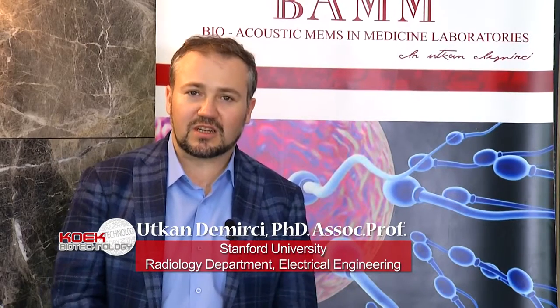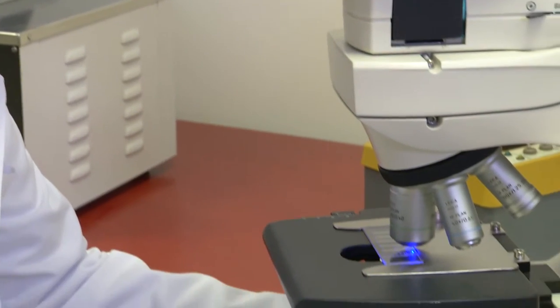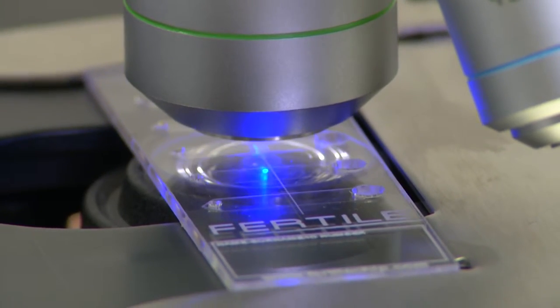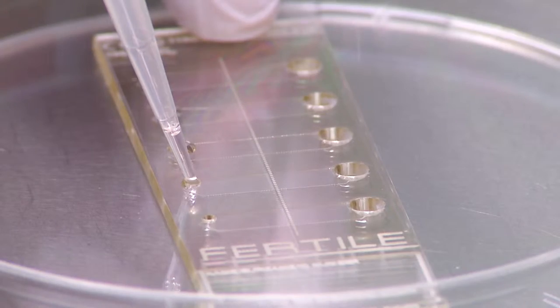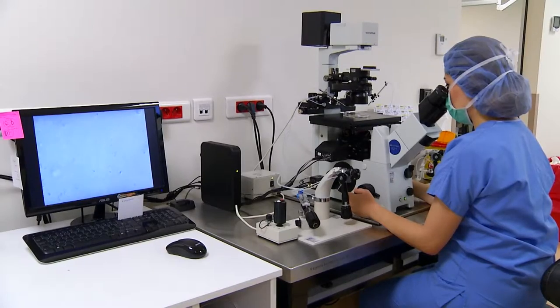This technology is inspired by nature in the sense that sperm moves in the vaginal walls through microfluidic channels to get to the egg, and it's pretty much programmed and designed to swim up towards the egg. Here we are creating that same type of path using microfluidic channels and microfluidic technologies to have the sperm race against each other, and at the end we end up picking the best sperm that can be used for ICSI or IUI procedures.